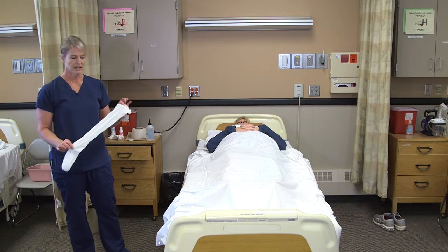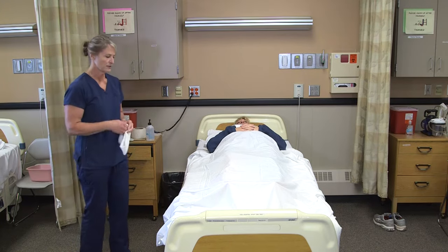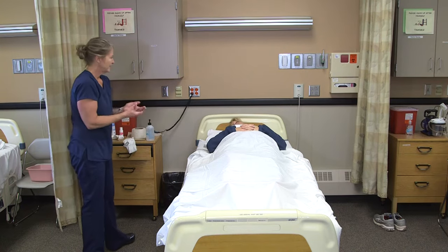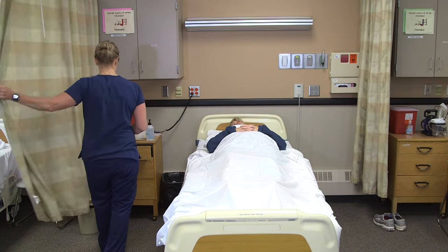To apply a Ted hose to a resident, all I need is the Ted hose or compression stocking, which are typically in their room. I'm going to knock on the door and wash my hands. Hi Annie, I'm Myra. I'm here to put your Ted hose on. We're going to provide for privacy.